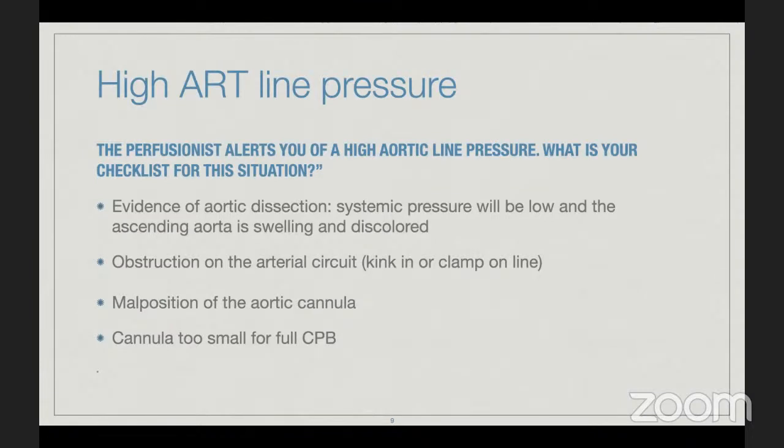Very good point. But there is a blue line. You have to align it with the aorta. When you use that cannula, you have to rotate. I mean, there's no way you don't do it. Very important. But sometimes you have the cannula against the wall. That's why when you put the arterial cannula, some people go a little bit deeper, so the cannula can be a little bit flat on the wall and doesn't come at 90 degrees to the posterior wall. So this is a good point. Some people do clamp the cannula, that's very true.